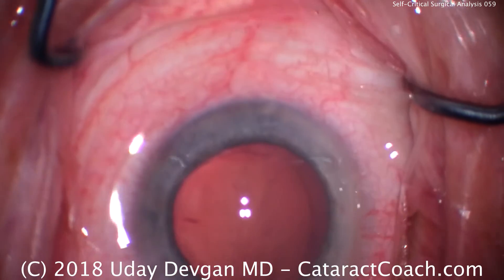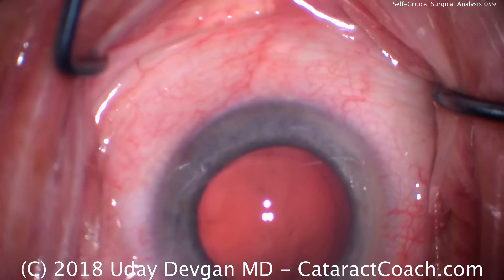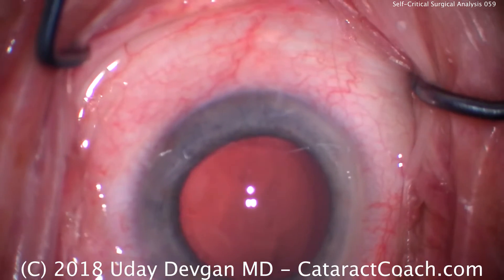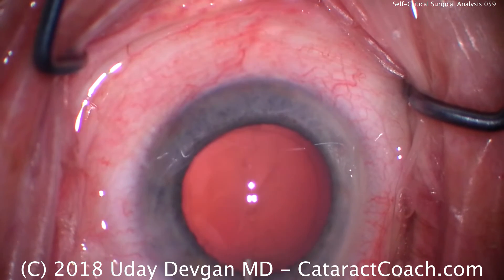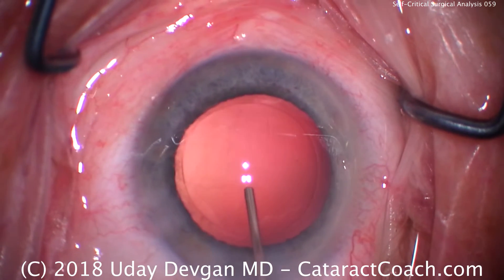We definitely need to learn to be self-critical — that's how I improve. So this case: I could have draped better, I should have held the eye better at the beginning when I had the fixation ring, and I should have had better hydrodissection. That would have made things more efficient.